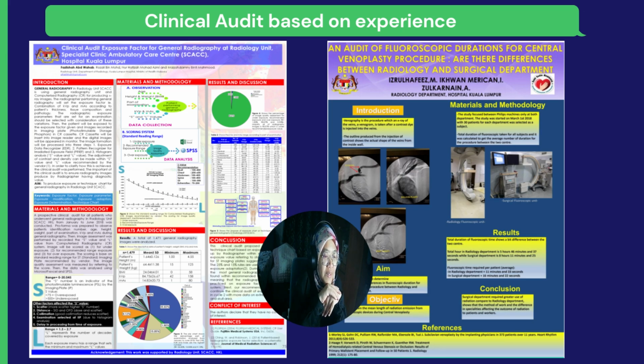So if you perform the audit, you do some data collection, so you can answer to other people. Like first one, you can answer whether radiographer actually push button simply or within the normal range of exposure while using CR or DR. The second one, what is the screening time for the venoplasty, which you can answer to other person.